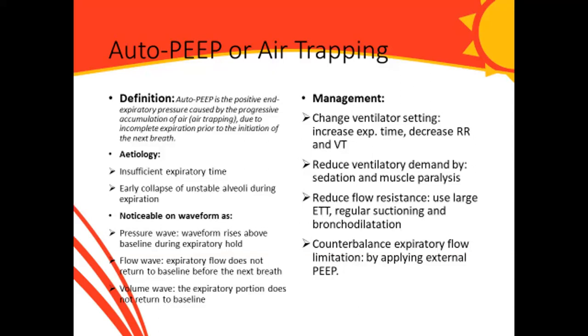You see that the waveform rises above baseline during expiratory hold. It shows you that there's residual air. In the flow wave, the expiratory flow does not return to baseline before the next breath. And for the volume waveform, the expiratory portion does not return to the baseline too.